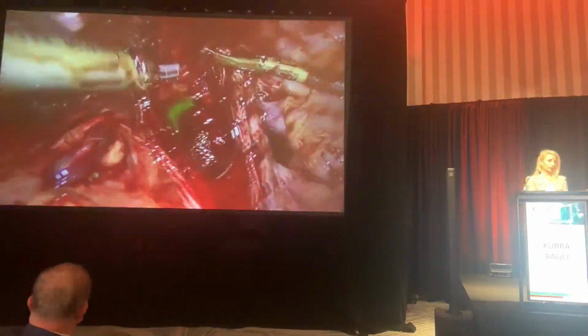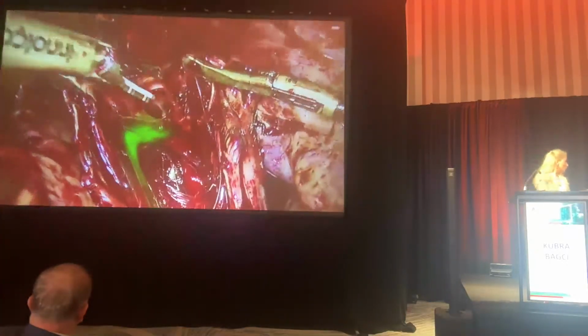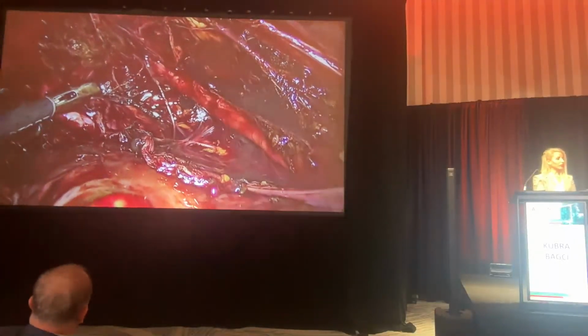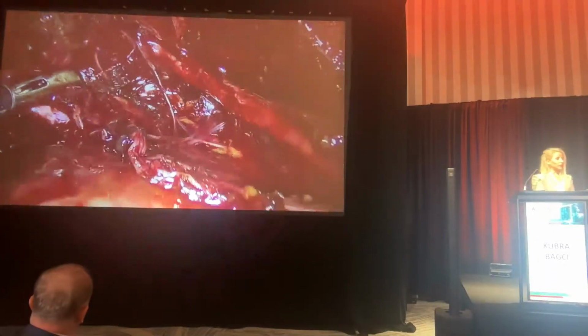Under ICG fluorescence, the right ureter was safely dissected. With ICG off, the field becomes complex and poorly defined. With ICG on, the ureter is clearly visualized.